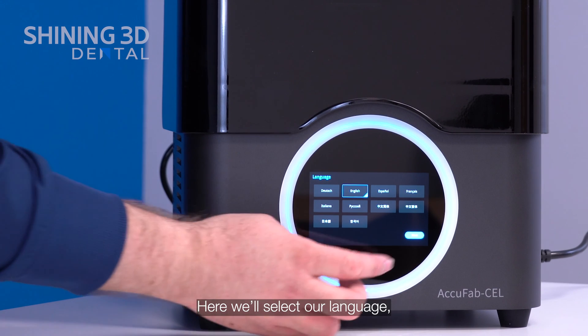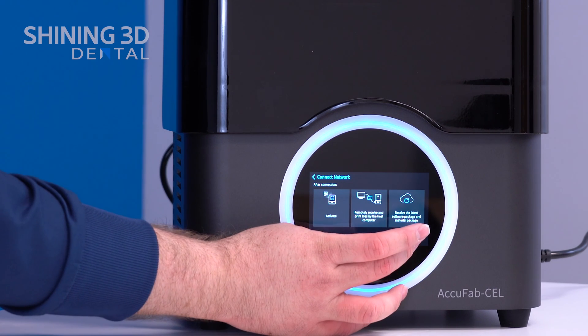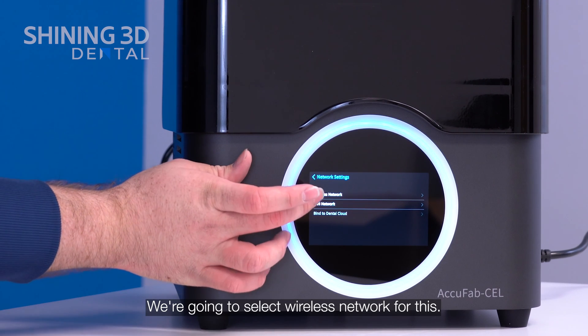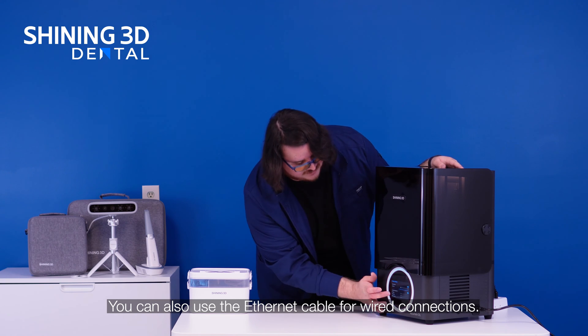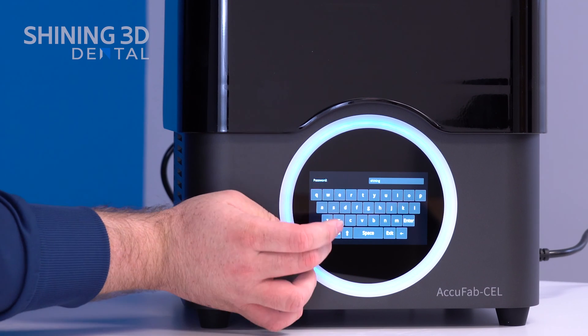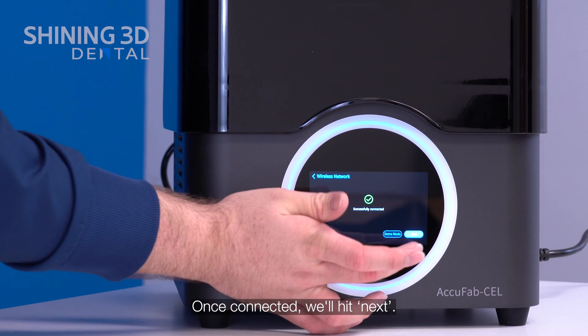Here we'll select our language and connect to Wi-Fi. We're going to select wireless network for this, but you can also use the ethernet cable for a wired connection. Once connected, we'll hit next.